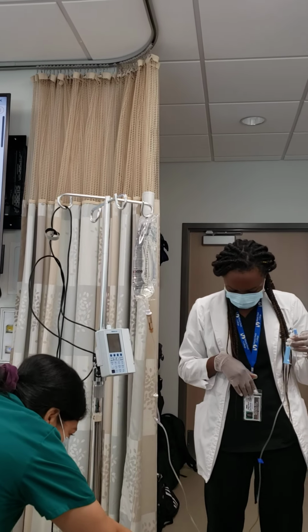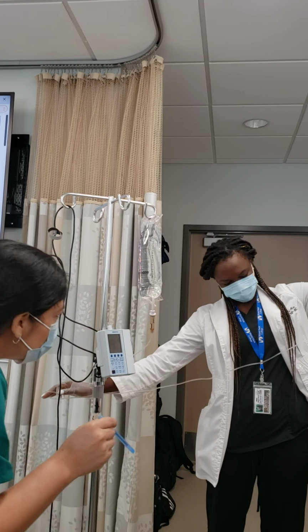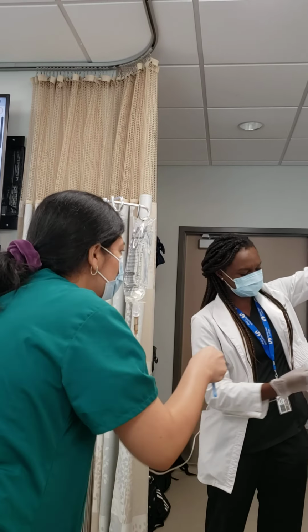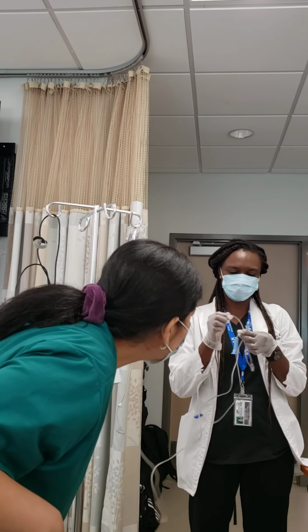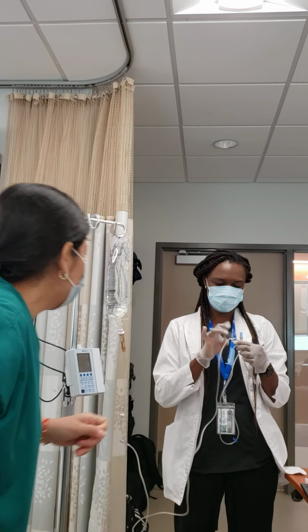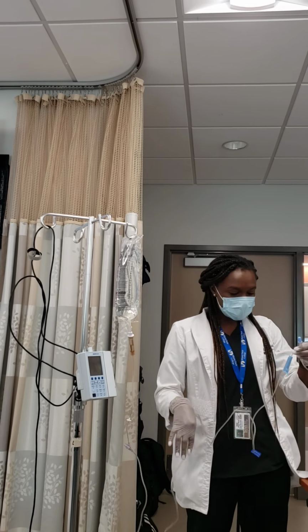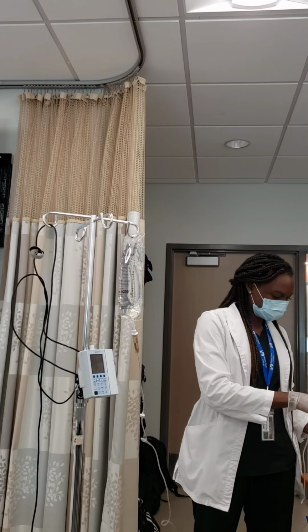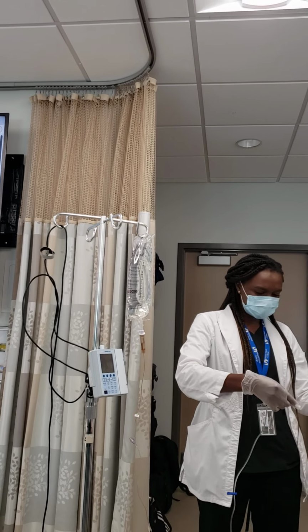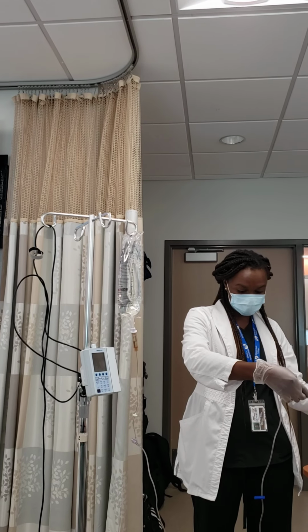There's another big one here, right? Let me see. Where is it? Okay, right in the middle. This is fine. This is not a problem. This one, just to learn. But for test purposes, just make sure there are no air bubbles, okay? This is pretty much not gonna hurt your patient unless you see the one that I showed you before.